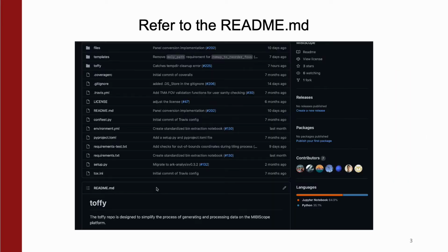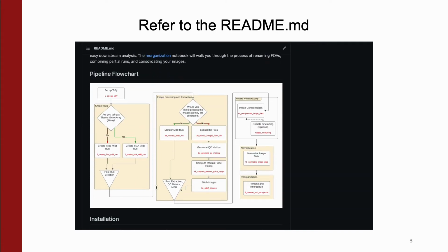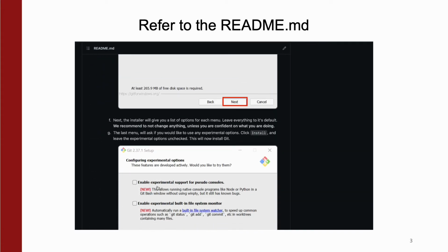The README contains installation and usage instructions for Toffy. If you're ever confused, please give it a read.